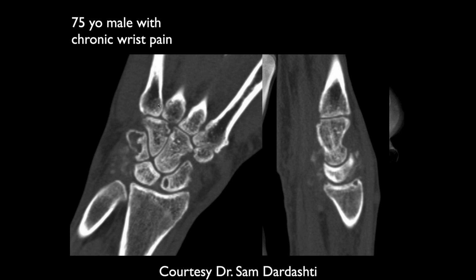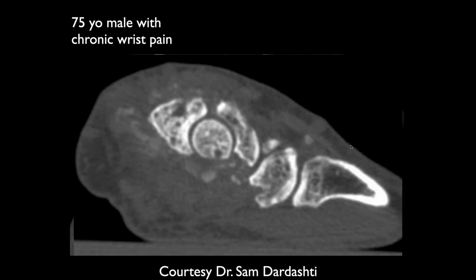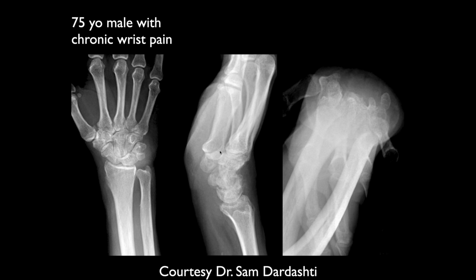So it looks like there's some non-specific cystic changes in the proximal scaphoid, a lot involving the triquetrum. There's maybe a little bit of degenerative change at the radioscaphoid joint, and then there's some little high density amorphous densities in the prestyloid recess and around. Those are calcific, aren't they? Yeah, little calcific, amorphous densities throughout the synovium. It wasn't really involving the joint, so it's not really chondrocalcinosis. It's more synovial type. And there's some erosive change as well. I mean, it could still be gout.